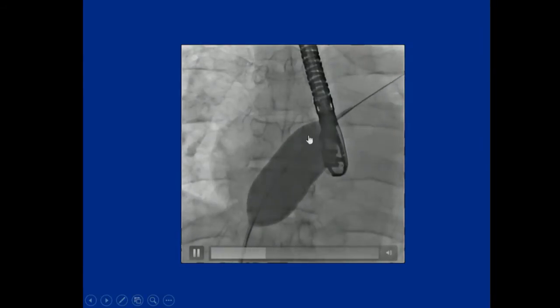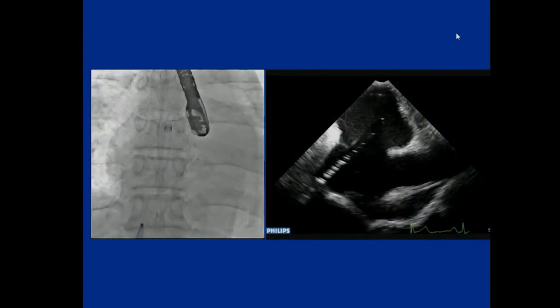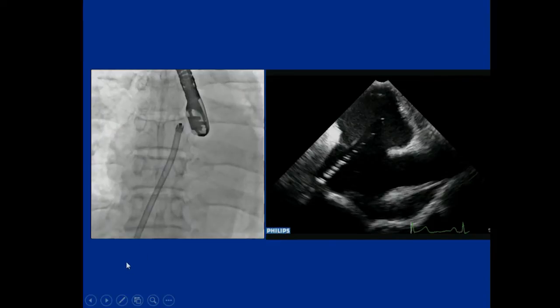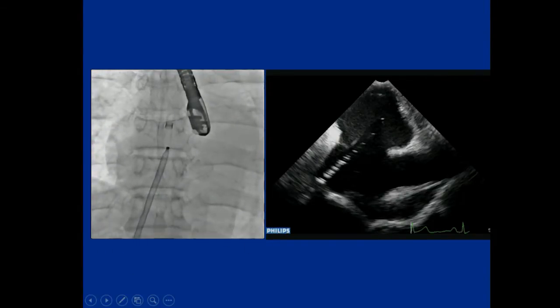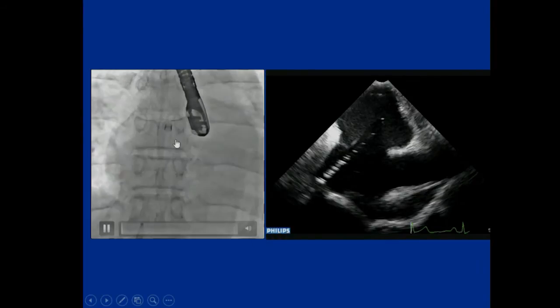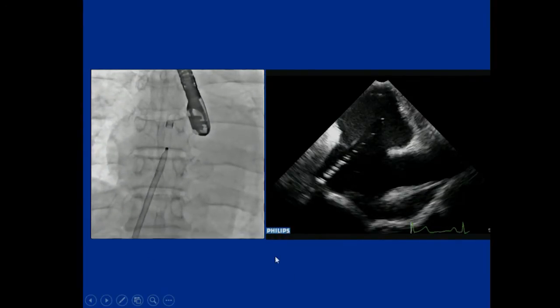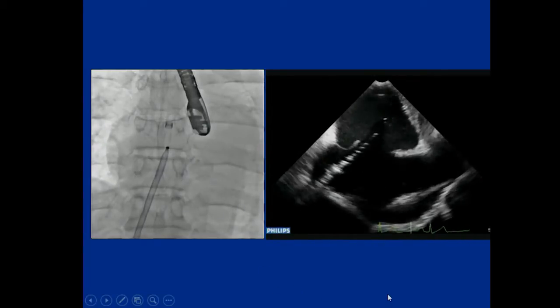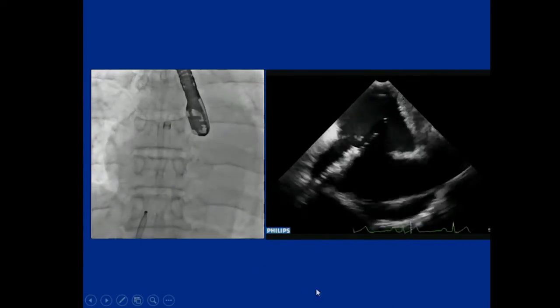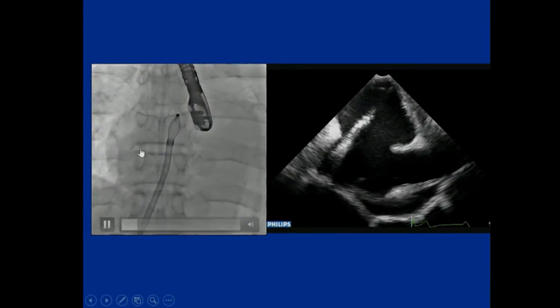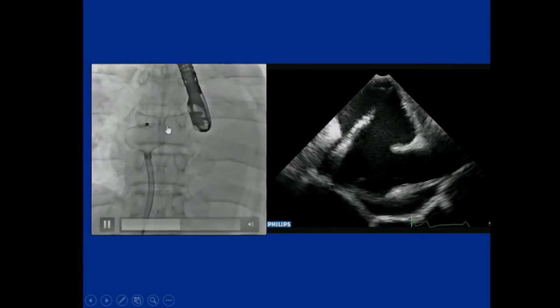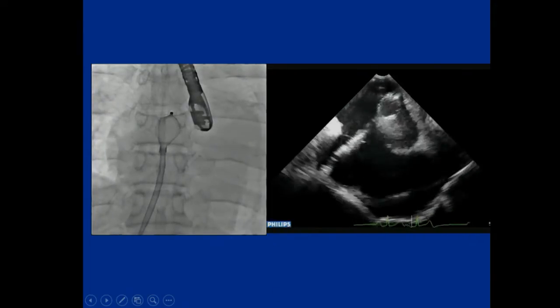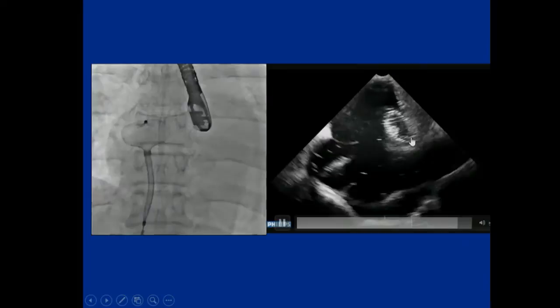We usually perform balloon sizing, but not always. This is the X-ray film showing the device approaching the left side via the so-called Hausdorff sheath. Echo shows the device approaching the left side, and then the device was deployed from the left atrium. It looks like the right side on fluoroscopy, but on echo the device was opened inside the left atrium.